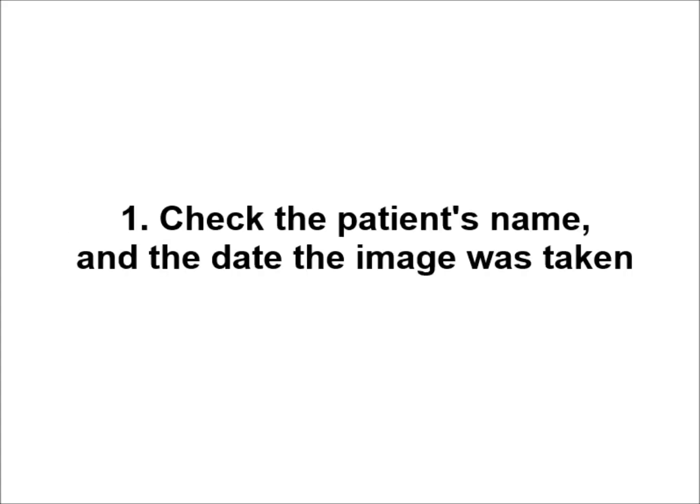Any systematic approach to reading a chest X-ray always starts the same way, making sure you have the correct one. So the first step to reading any chest X-ray is: 1. Check the patient's name and the date the image was taken. It seems obvious, but make sure you have the right X-ray for the right person.